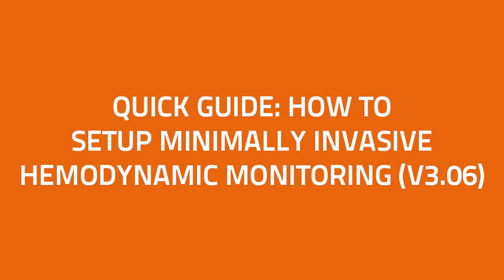In this short video, I'll take you through how to set up a LIDCO monitor using an existing arterial line.